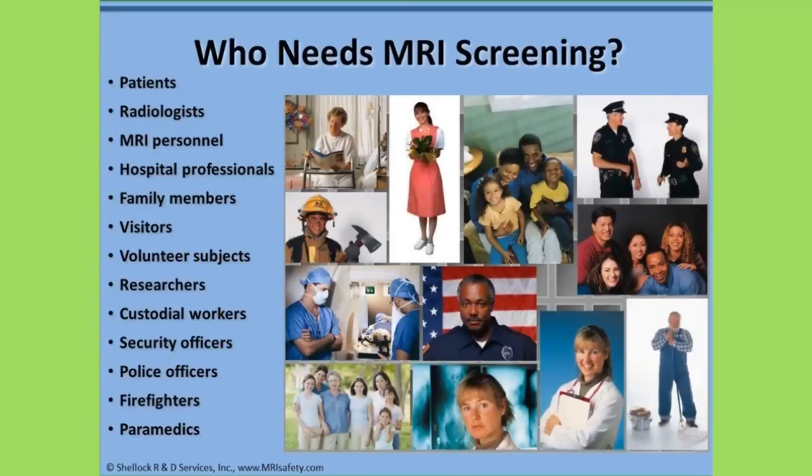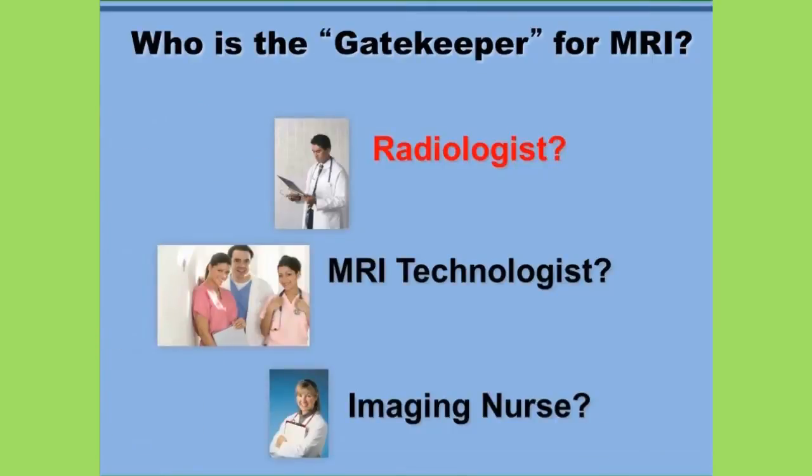In order to ensure that there are no current MRI issues related to a change in the medical status for these individuals, especially if an implant or device was recently placed, the screening procedure should be repeated prior to each MRI encounter. While MRI technologists and imaging nurses tend to be the ones who commonly conduct screening procedures, in fact, it is the radiologist at the MRI facility who is ultimately the person responsible for making the final decisions regarding important MRI safety matters, especially in cases that may be complicated or challenging.